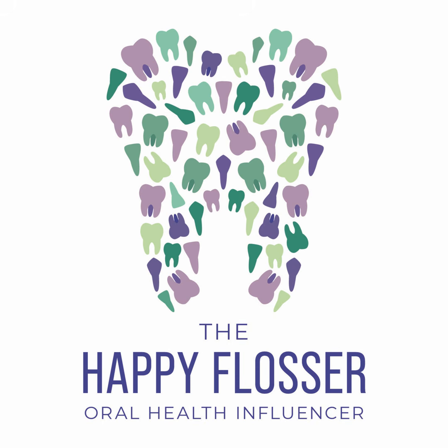So when you make your model, you have certain criteria. And I would say there's two main things that students struggle with when it comes to models: air bubbles and breaking the teeth off when we go to separate. So you want to be really careful of those two things. The reason why some of us break the teeth off is either we didn't create a big enough base when we poured up the impression material, or we tried to separate it too soon.